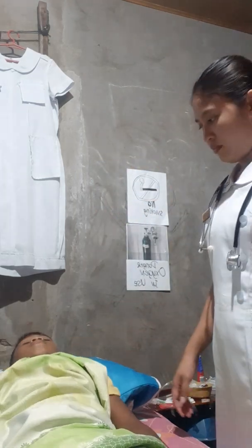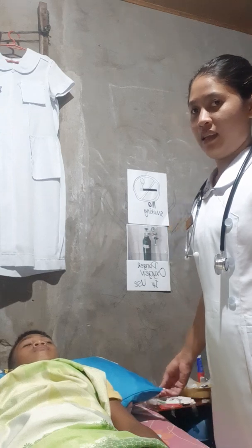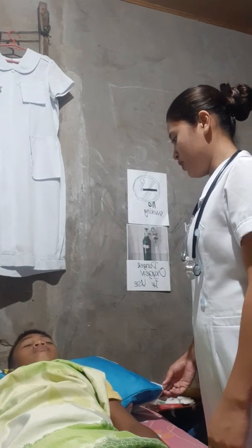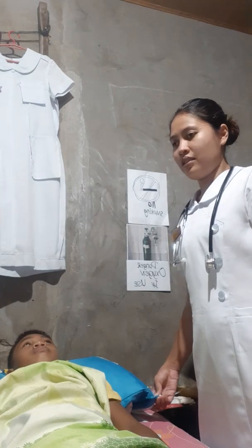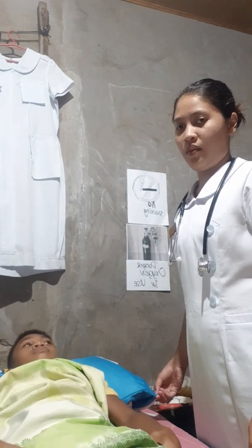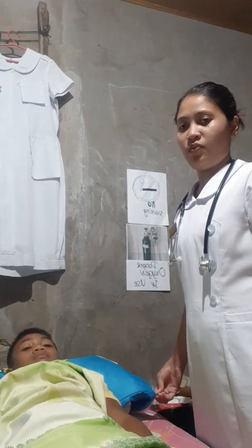Afterwards, introduce self and verify the client's identity. Good day, sir. I'm Nurse Madel, your nursing aide for today. May I know your name? My name is Joshua. Okay, thank you. Verifying the client's identity is to prevent any misidentification or mix-up of patients.